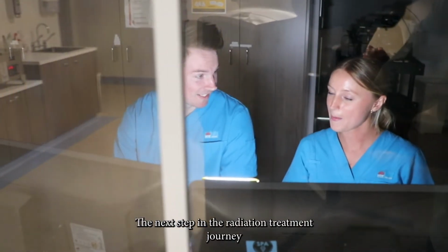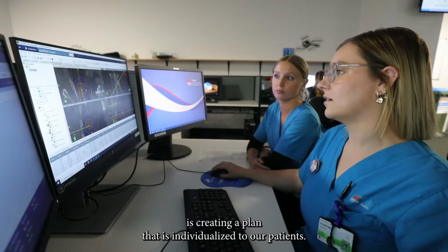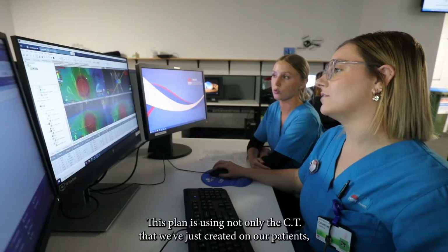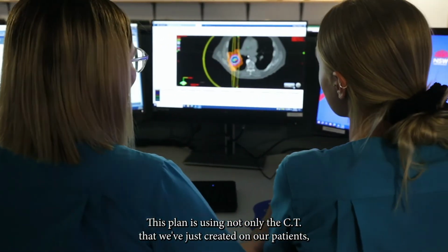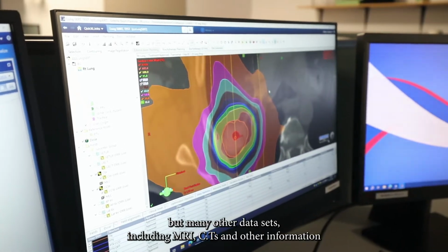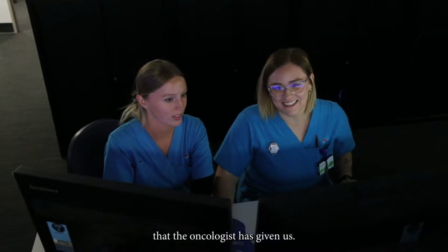The next step in the radiation treatment journey is creating a plan that is individualised to our patients. This plan is using not only the CT that we've just created on our patients, but many other data sets including MRIs, CTs and other information that the oncologist has given us.